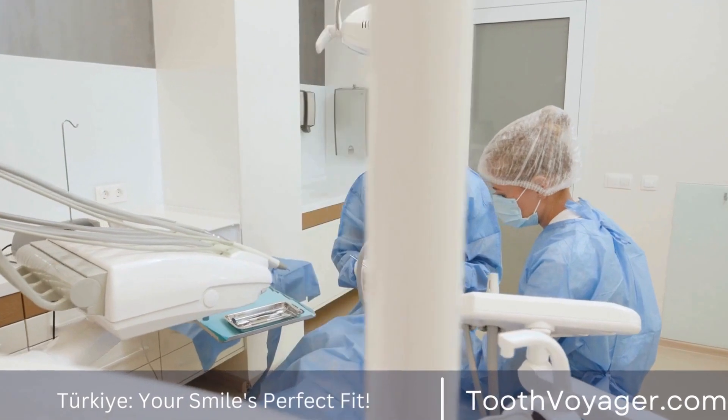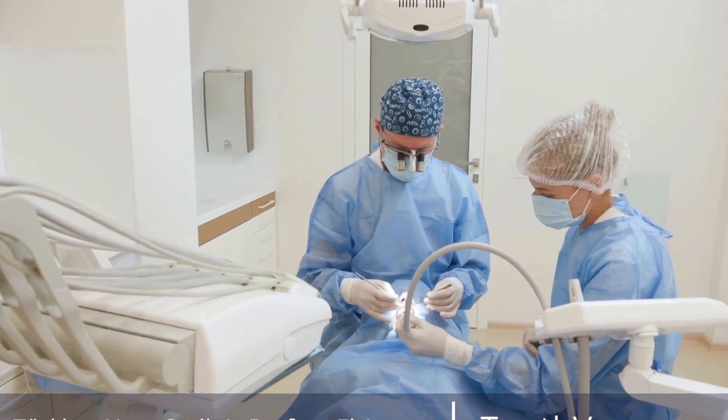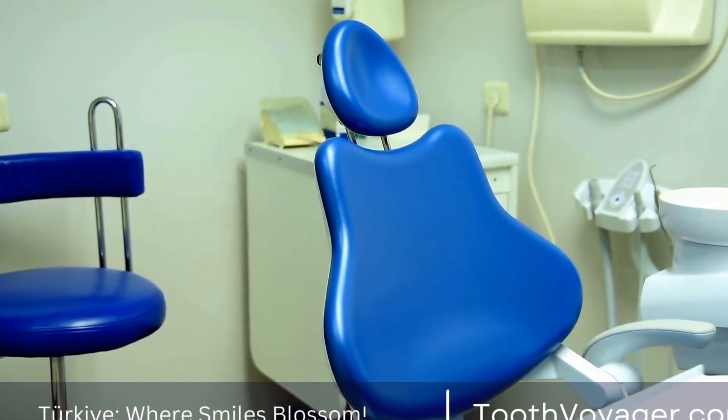Porcelain crowns are known for their natural appearance and ability to mimic the translucency of natural teeth. They are stain-resistant and durable, making them a popular choice for front teeth.